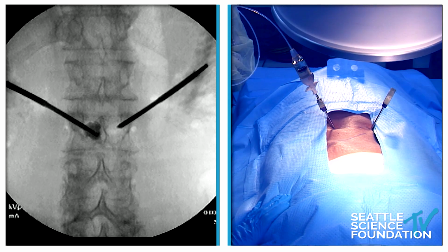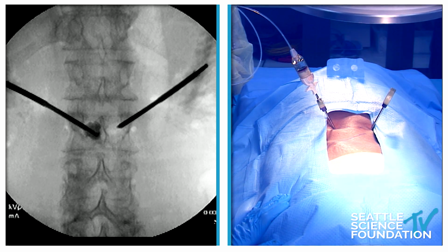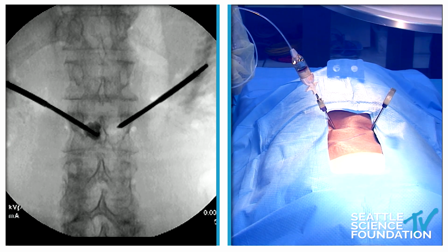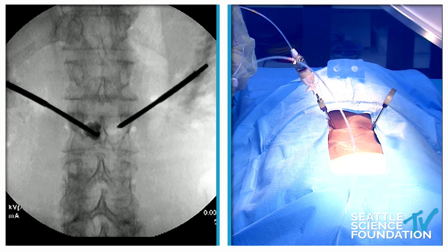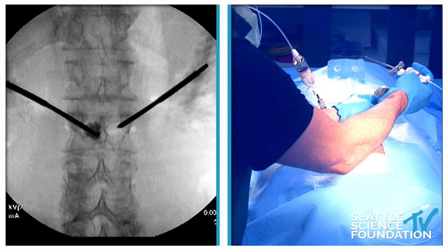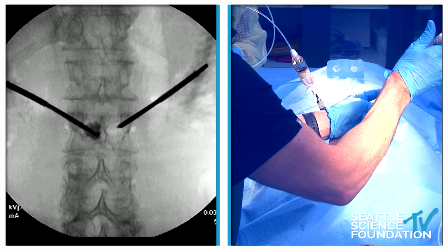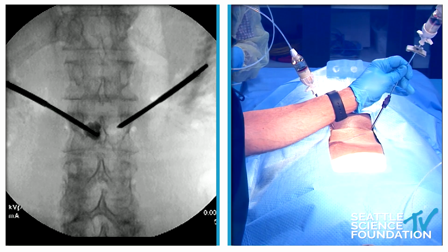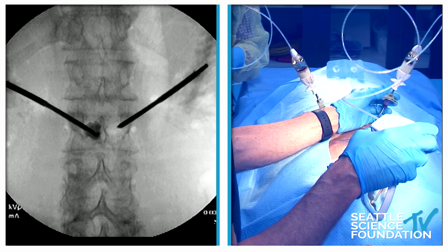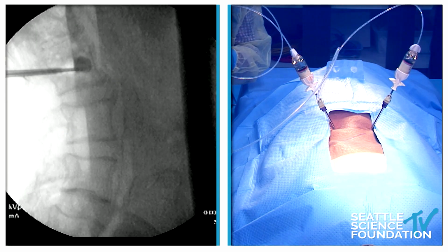When doing cement injection, Doug, do you usually use a lateral view? Always. So we're going to flip to lateral, and we know that that's going into the path of least resistance, which is the pathway of the balloon. And this is also X-speed cement, so this is a quick-to-dough, mix-and-go cement. It comes out at about 500 to 600 Pascal seconds in terms of viscosity. It's got about an 8-minute working time. And so fairly good control.